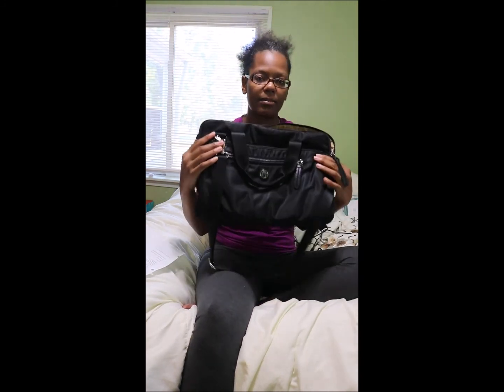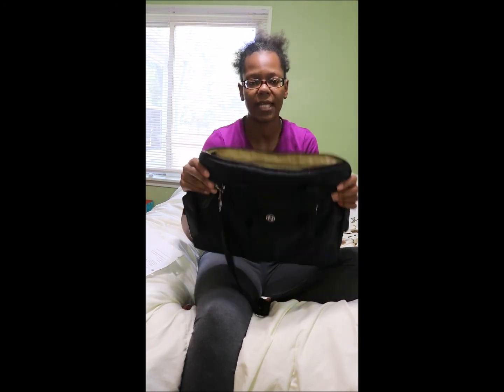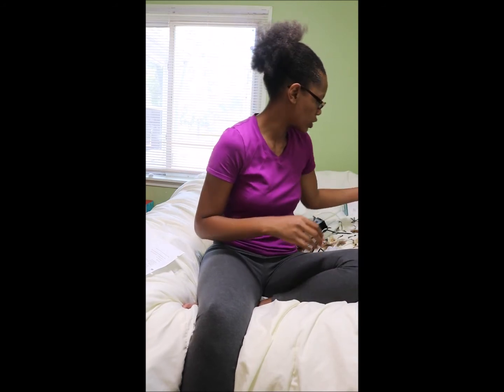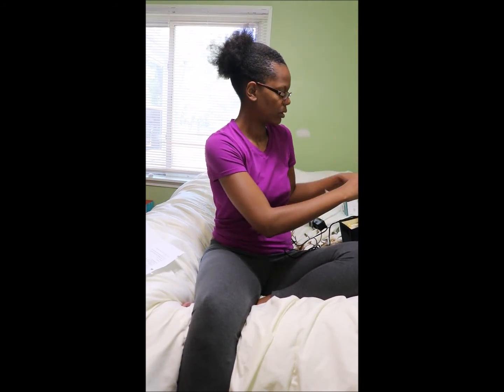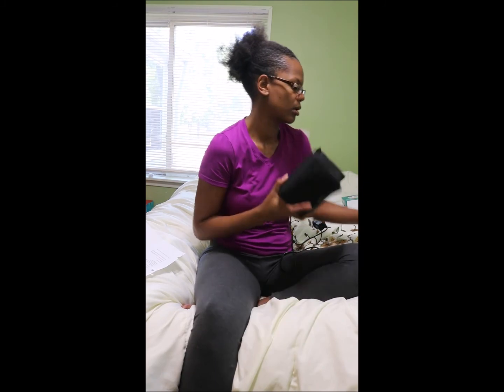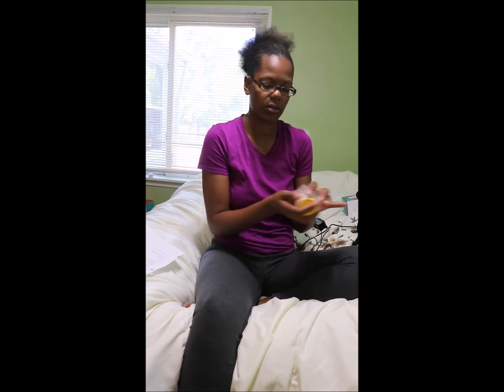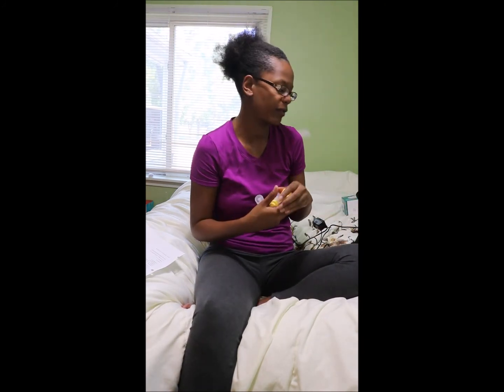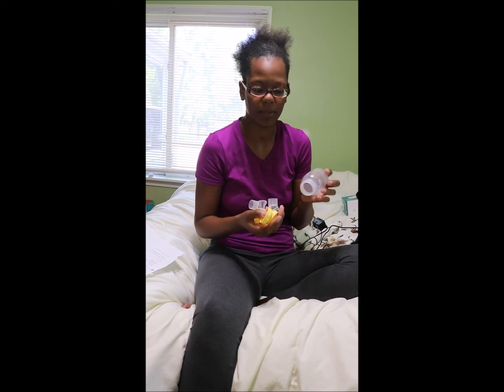I take my breast pump with me to work, and I carry it in this bag. This is not a pumping bag, but it doesn't matter. This is actually an old laptop bag that I have. And when I want to store it, I just take these cords, wrap the cords up, and then you put it in here and you can close the lid, and that keeps it together. And you just put it in your bag. Now, as far as the equipment, what I do is I just put this in a large Ziploc bag and put some paper towel in there, because once I rinse these out, the paper towel will catch all the excess water.